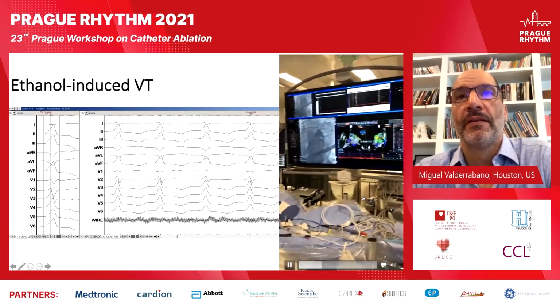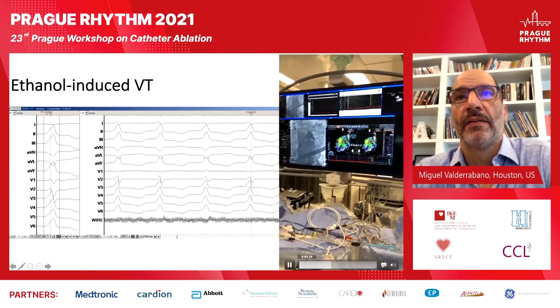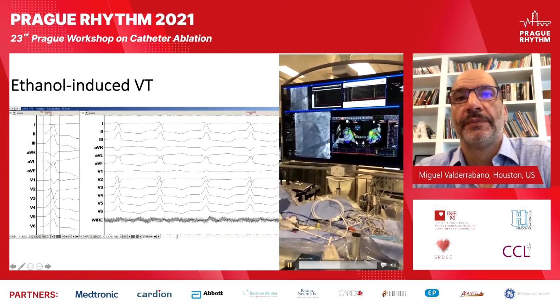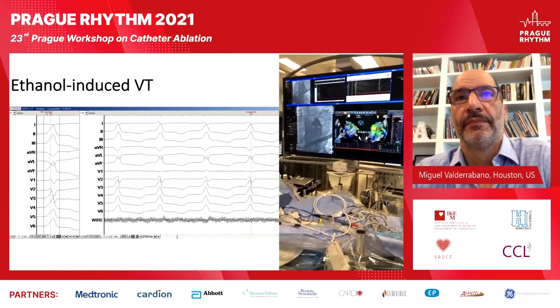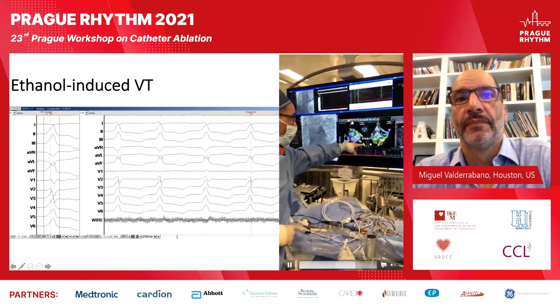She transiently developed right bundle branch block with one PVC fused, and then it went away. Then we'll see if we have any doubts. What we will do is ablate in the adjacent areas to complement what we have achieved with alcohol.